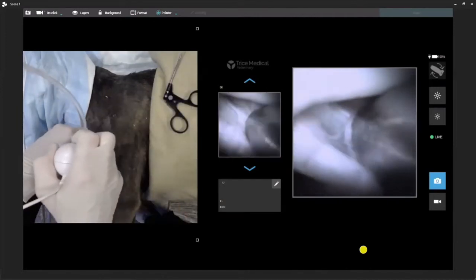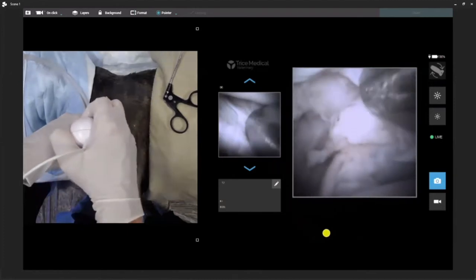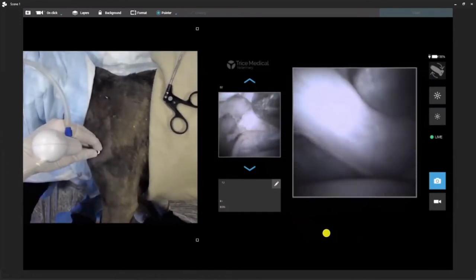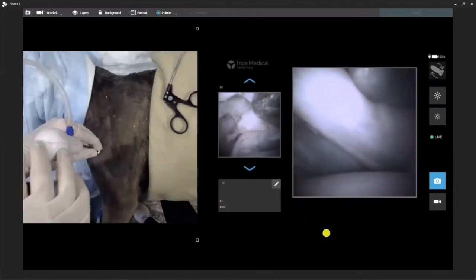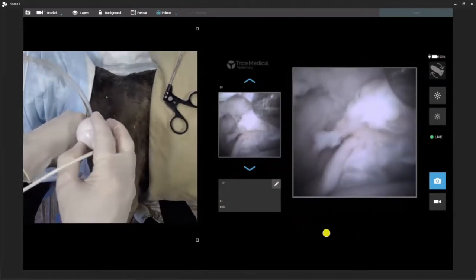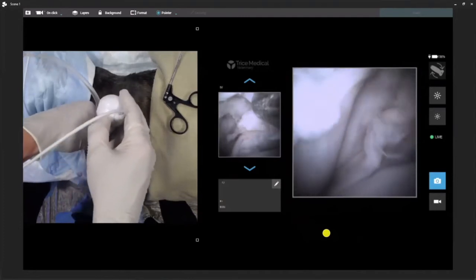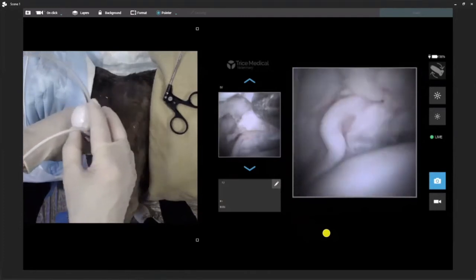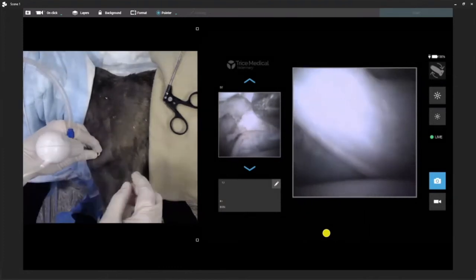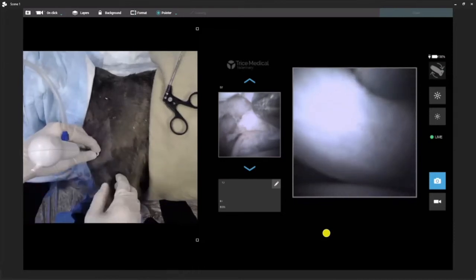We can go ahead and capture these images for our records, for our referring doctors, and for our clients. Any questions before we come out of the shoulder? The main principle here was that the optics are very good, the quality is good, and we can drive to pretty much any location — cranial or caudal — within the joint. And obviously, based on our portal placement, we can do our treatments as well.